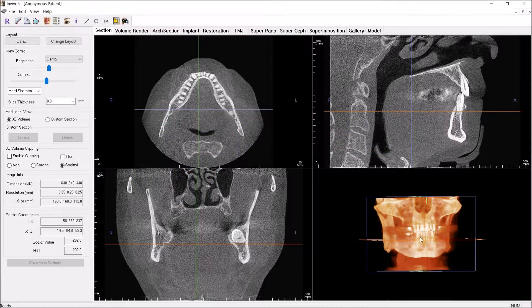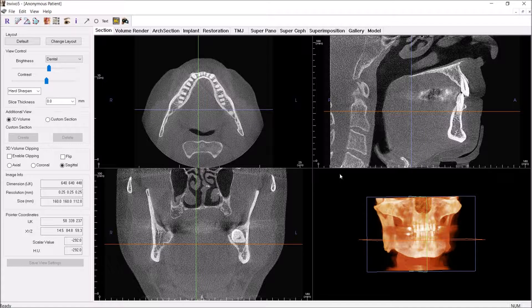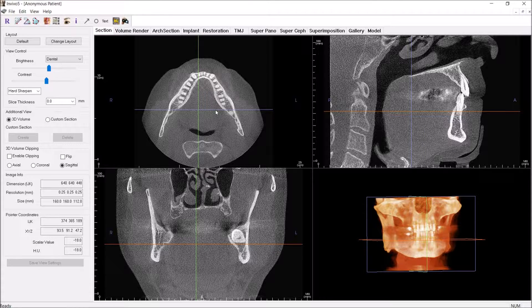I'm going to take you quickly through what I do when I interpret a Conebeam CT. This is a 65-year-old patient, and this was taken on an iCat Flex machine.